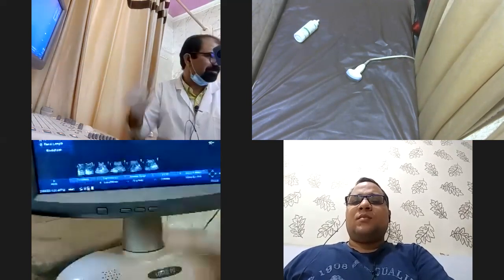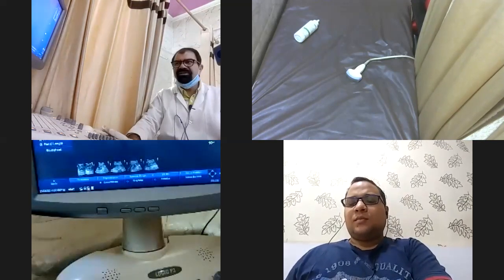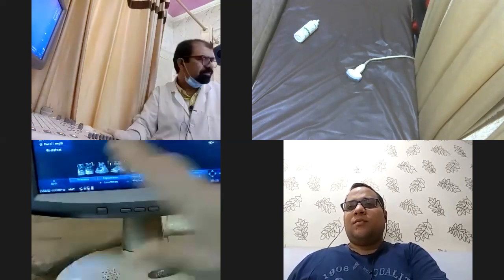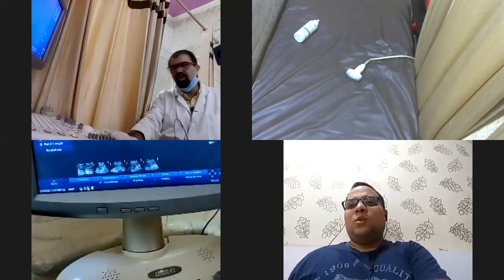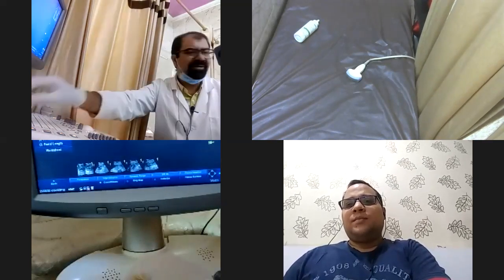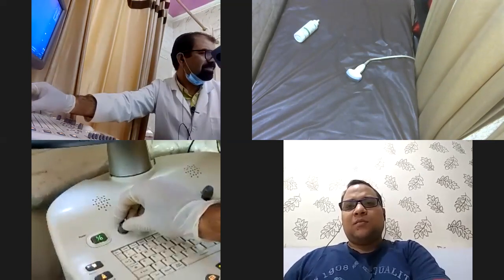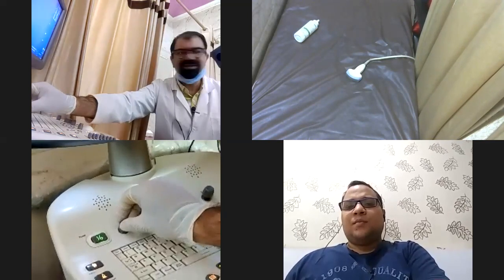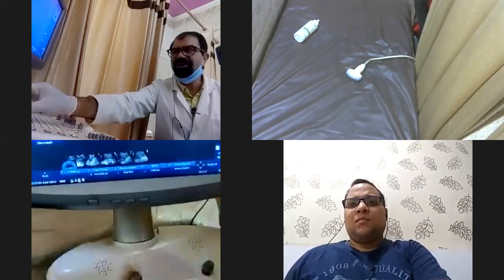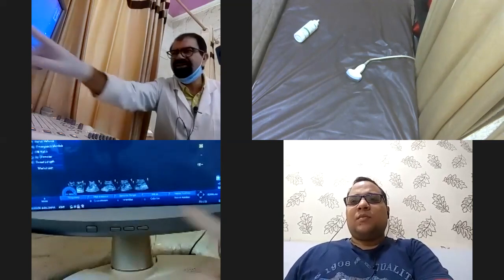Now, a question. For an obese patient, what should be the frequency? High or low? Low. Lower. Why? Because I need penetration. Now this is the knob over here by which I can set the frequency. By increasing this, see, I am setting the frequency over here. So the point is, you know the frequency and how to set it.